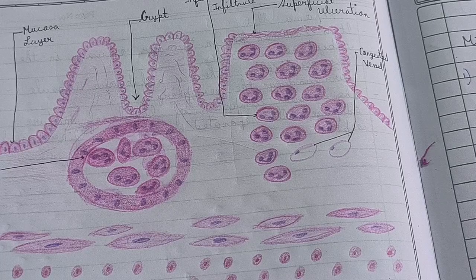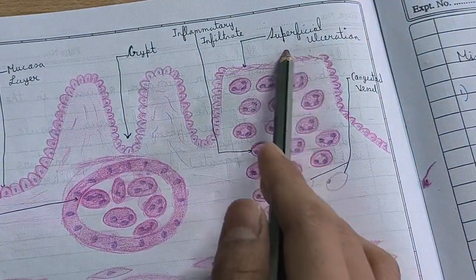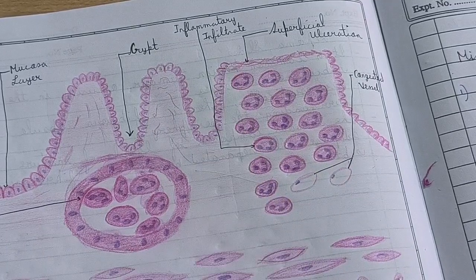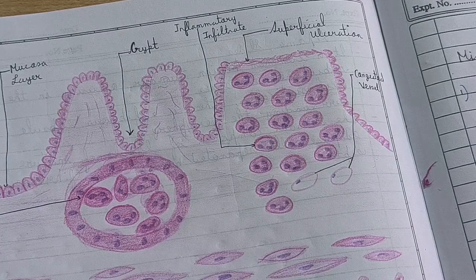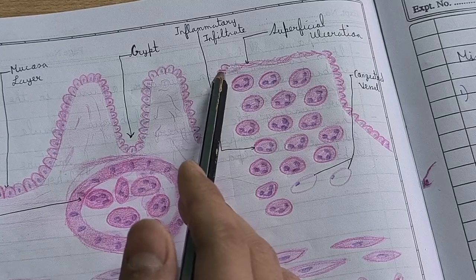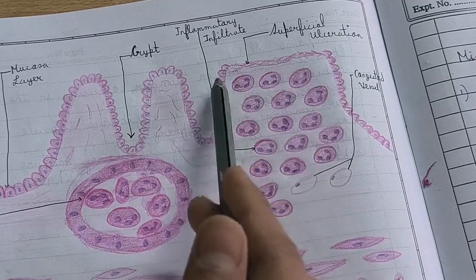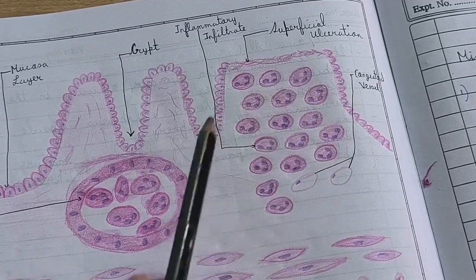But in this case, you can see in this region that there is a discontinuation between these 2 mucous layers, and this discontinuation of the mucous layer is due to an ulcer. So in the histopathological diagram, the ulcer is found in the region where there is a discontinuation of the mucous layer.